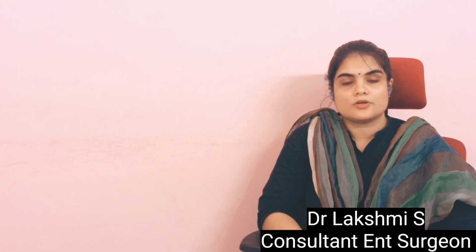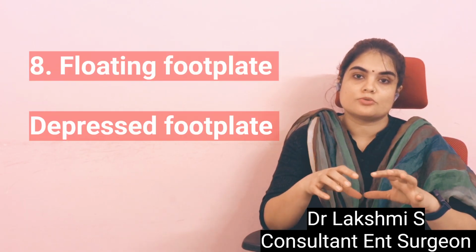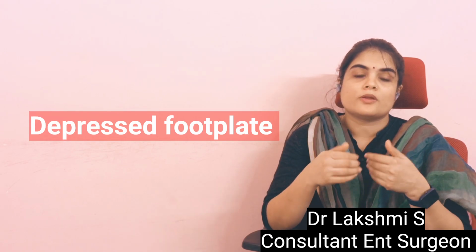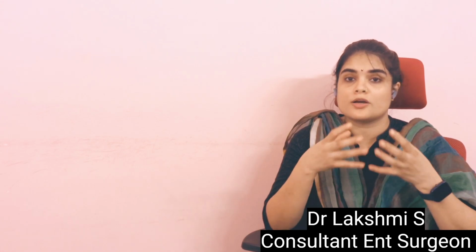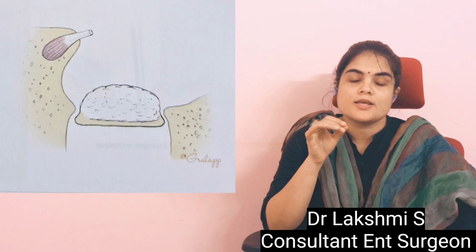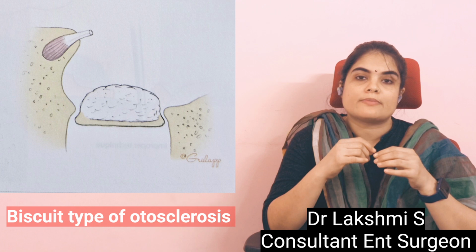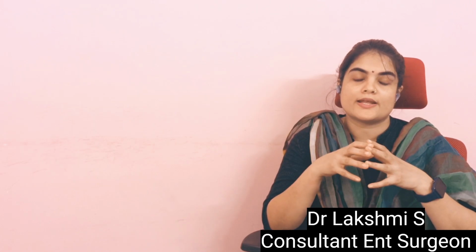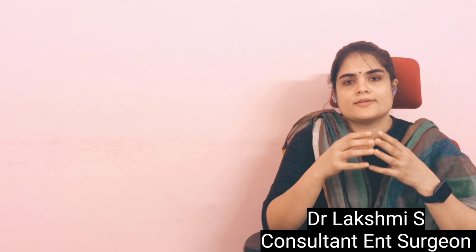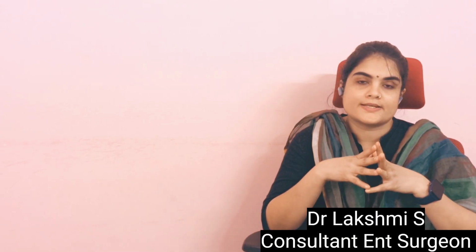Another complication is floating footplate. So the footplate has irreversibly depressed into the vestibule. So the more we try to remove it, the more problems it creates. It can create sensorineural hearing loss and long-term vertigo. The main thing that causes a floating footplate is a biscuit type of otosclerosis. The moment you start to create a fenestration, it will start moving. In these cases, you can use a maneuver known as the log roll maneuver. Laser can be used to create a fenestration and introduce a prosthesis. So once the footplate is depressed into the vestibule, it almost always causes long-term problems and hearing loss.